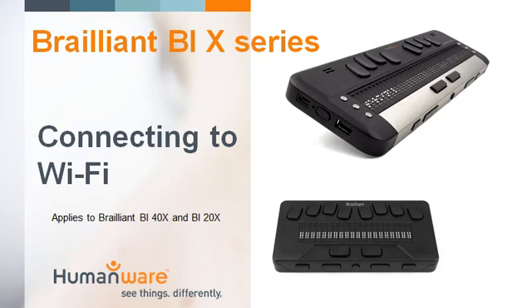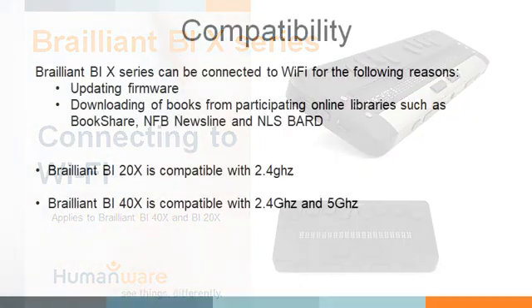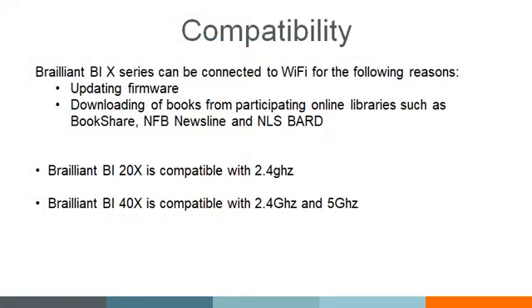Another snapshot tutorial video on the Brailliant BI X series. In particular, in this video, we're going to look at connecting our Brailliant BI 40X to Wi-Fi. The Brailliant BI 40X will connect to 2.4 as well as 5 gigahertz networks. So that's very important. You can certainly connect to either of those network types, and I'm going to walk us through how that is done.